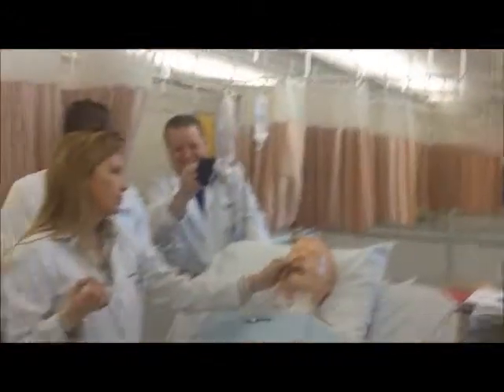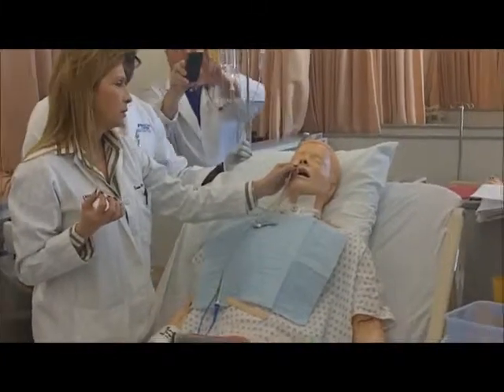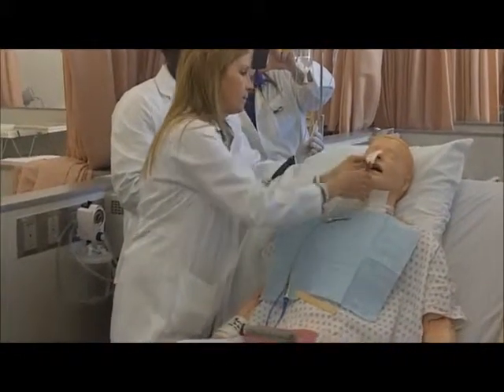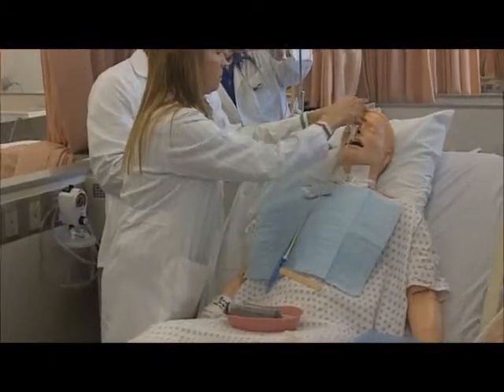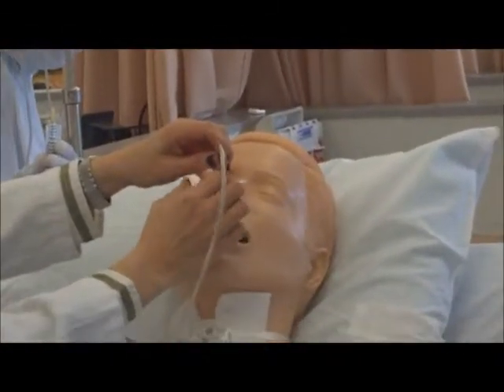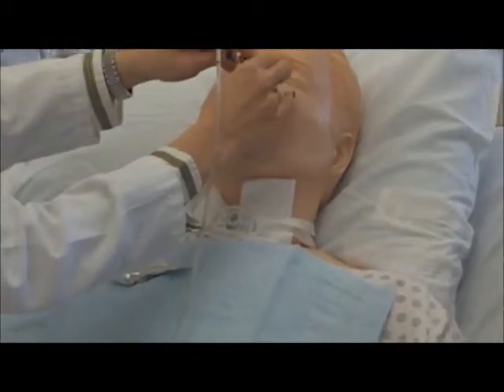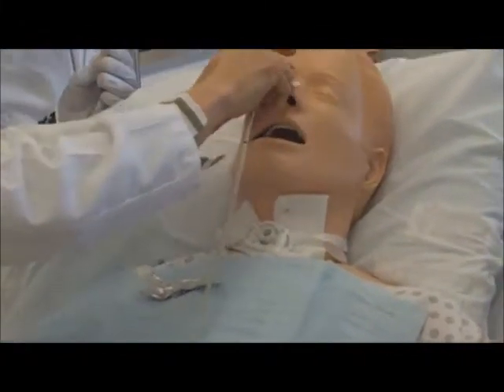If they're in the ICU, and they're going to be in the ICU for a couple of weeks, they usually get sweaty, they perspire. So wait a couple minutes, and then probably a little bit longer than that. Then you place this on the bridge of the nose. Wrap around one side. And then wrap around the opposite side. Okay, and then it's in place.